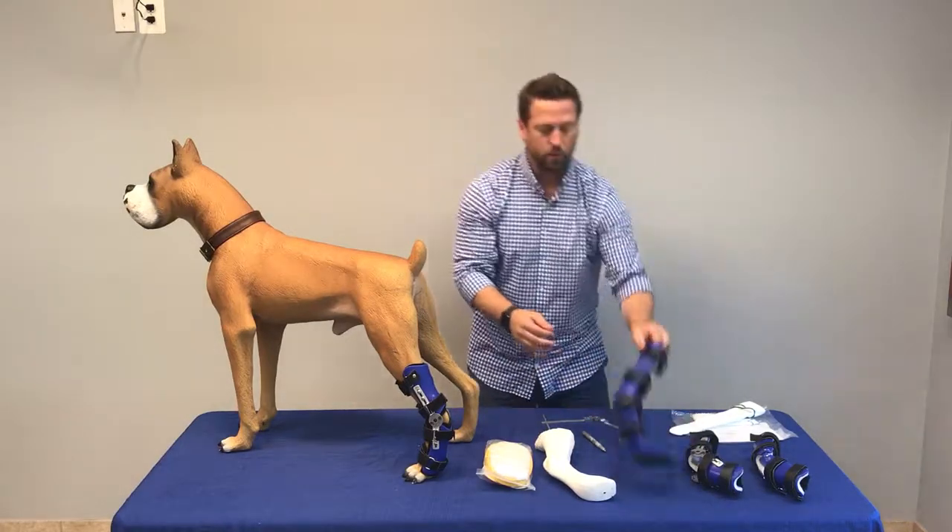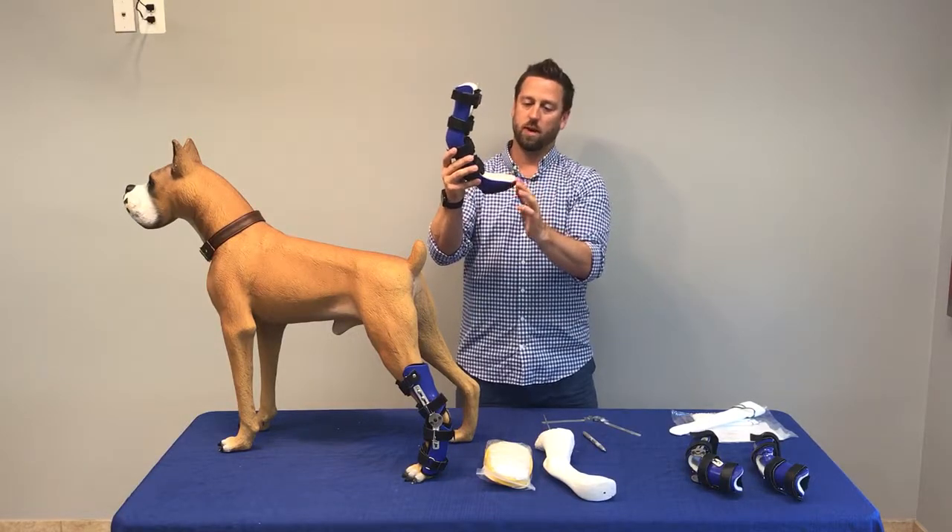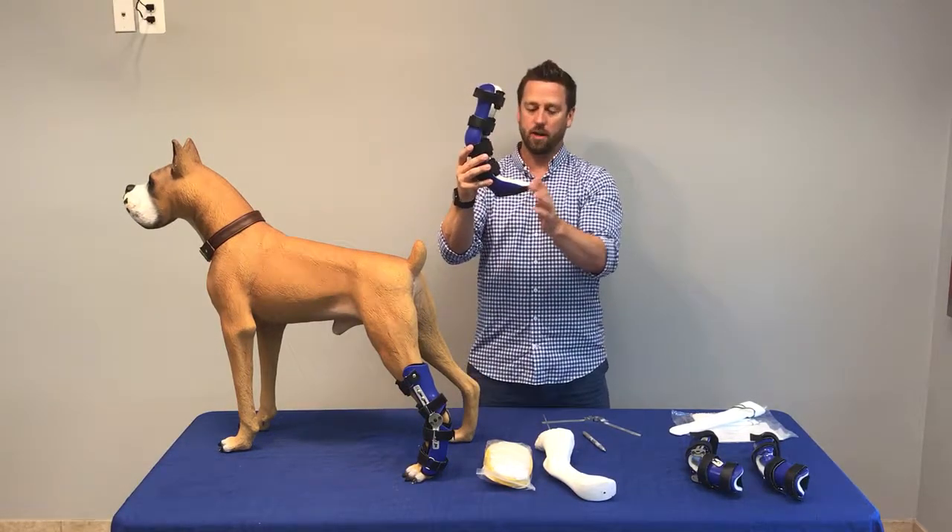We also make these with or without the paw section. Don't worry — we will always specify what the best option is if you give us a call here at Animal OrthoCare.